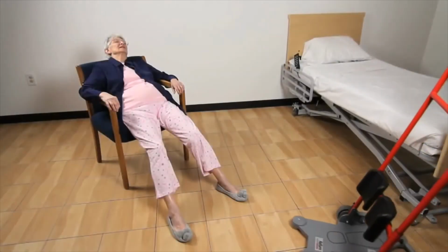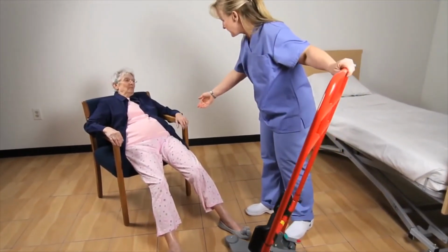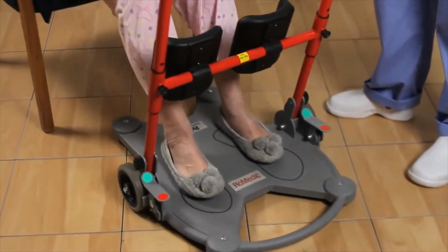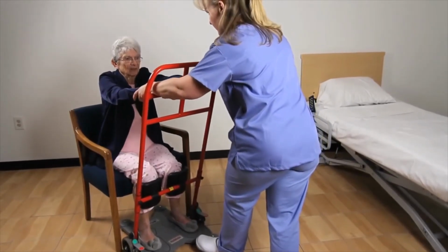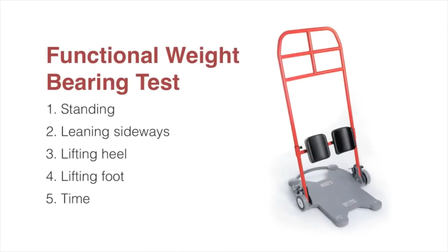Another application of the Return is helping someone move back in their chair from a slouching position. Position the Return in front of the chair and ask the patient to place their feet on the base. Ask the patient to pull themselves up so that they are not touching the seat. Next, push the Return towards the chair with your foot, repositioning the patient's buttocks completely back in the seat of the chair. Additional benefits of the Return 7500 are functional weight-bearing testing and the ability to exercise at the bedside.